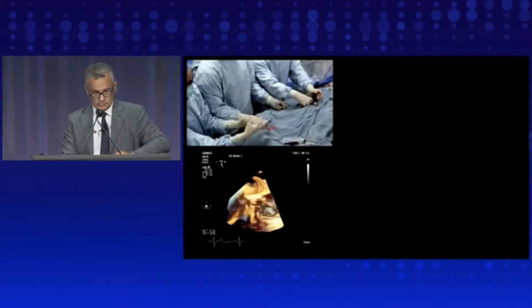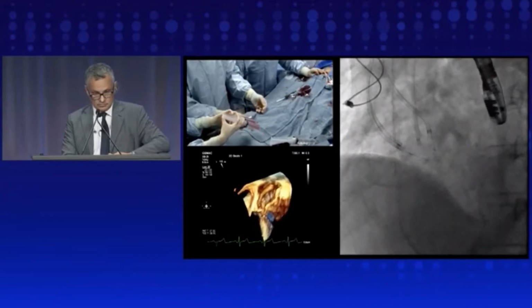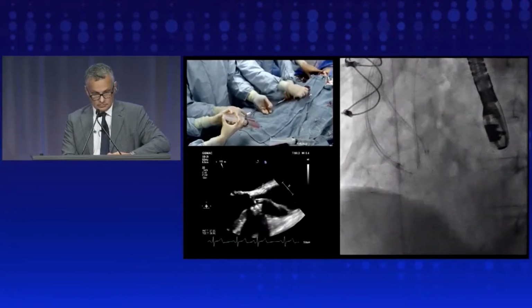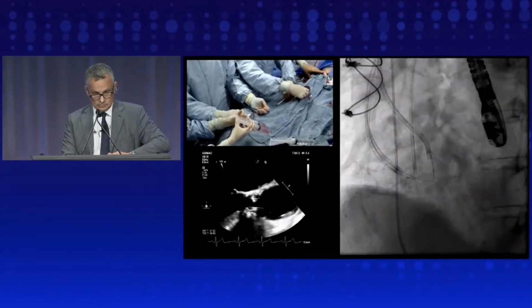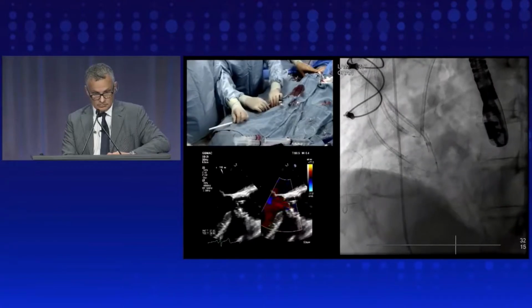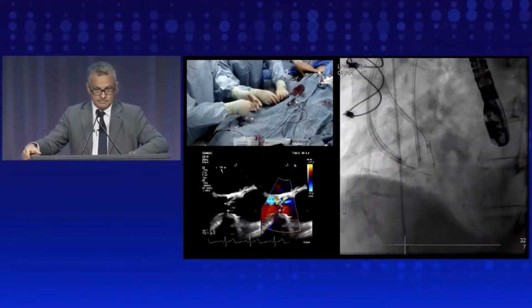So we are ready to do the cut, the laceration of the right cusp. You have two catheters that are related to the left cusp that will not be related to what we do now. You can hold it now. So we're injecting the dextrose, Bovie's on, and that's the pull. Okay. And you can see that little bite, sort of a little extra pull that has to happen there, and beautifully traversed it.